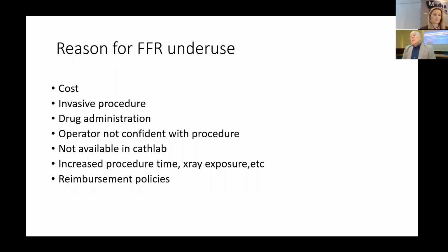Why is FFR used in so few cases? The first problem is the cost. The second one is the invasive procedure. You must use a guide wire, a pressure wire. Mechanical characteristics are not so good, like the normal guide wire that you use in your PCI.